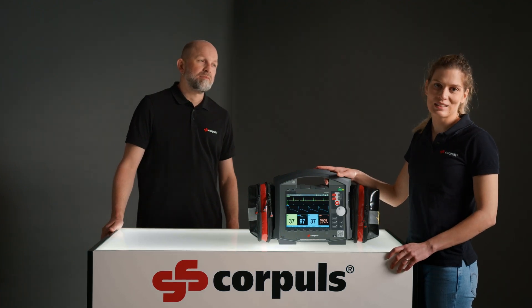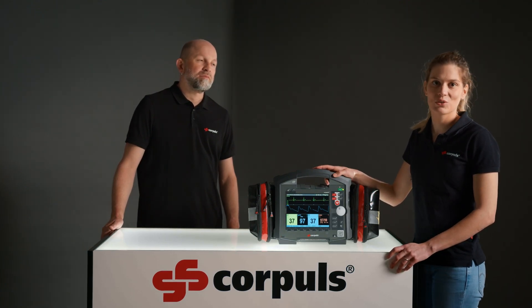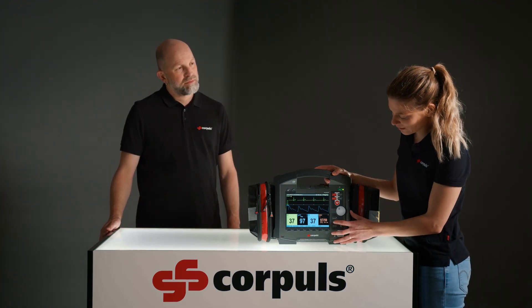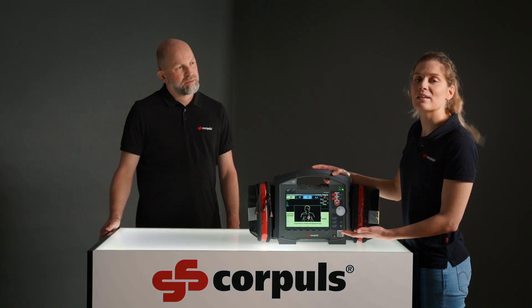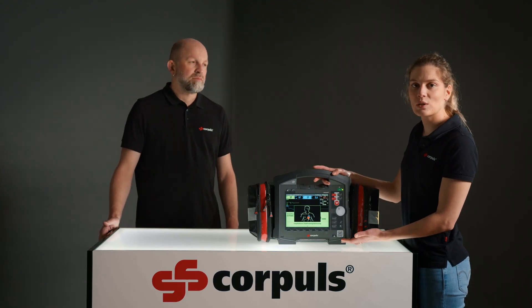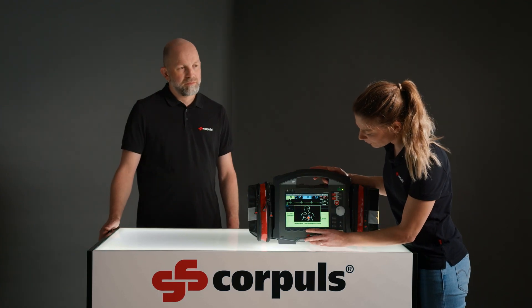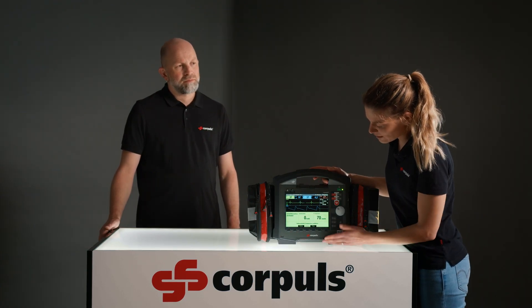Now we will show you how to carry out PACER therapy. To do this, we open the relevant menu by pressing the PACER function key. We are shown the information about the recommended electrode placement again. Since we have already done that, we can confirm it. And now we are in the PACER menu.